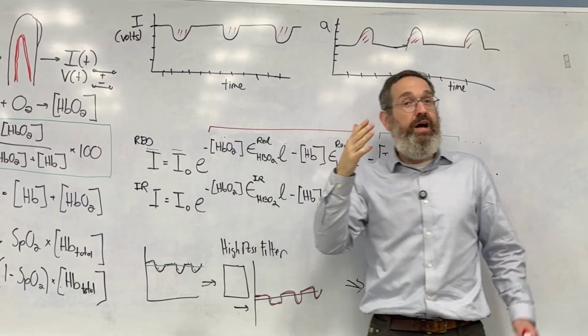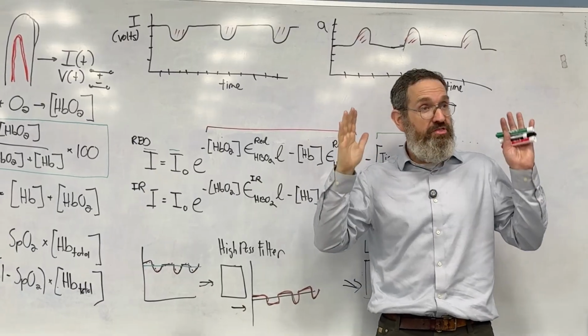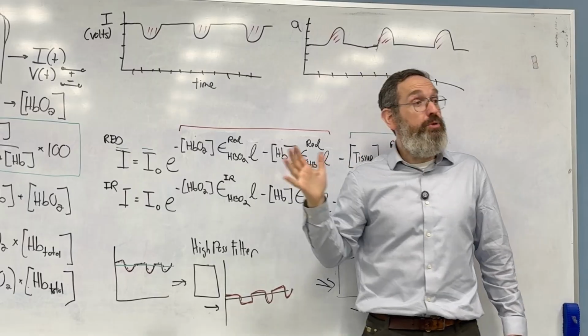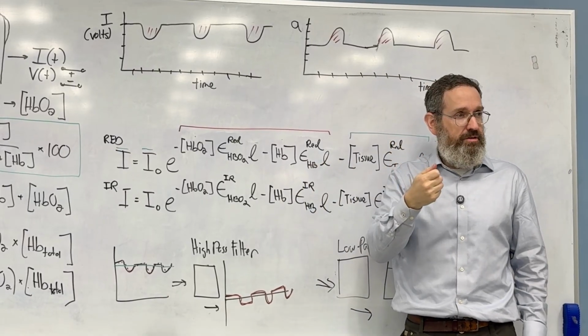So I don't need to know Emily's signal. I don't need to know Emily's noise. I just need to know this general thing, that when it changes on Emily, it's blood. The power of filters, that we don't need to know this information.